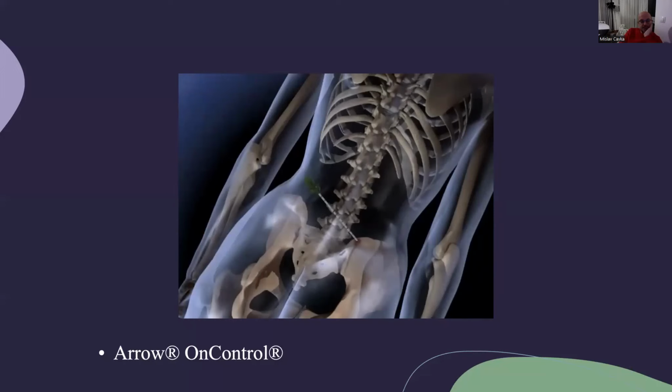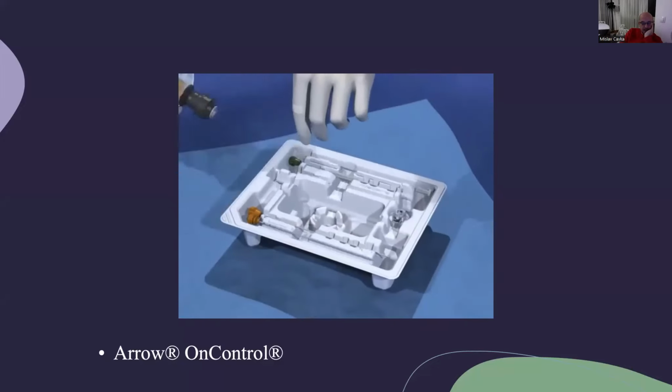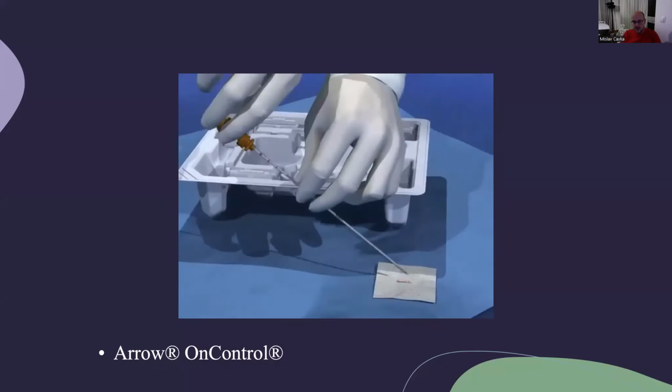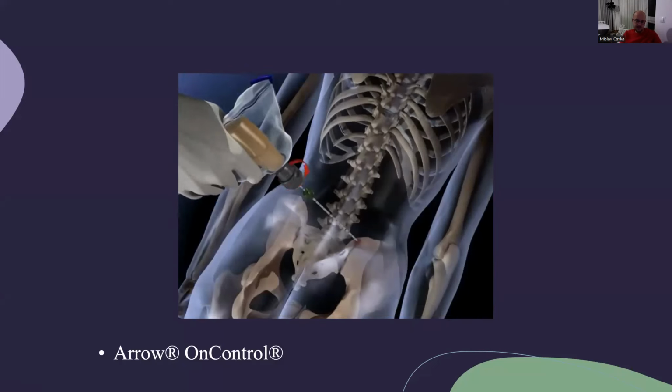Then through this coaxial guidance needle, we insert the bioptic needle, and we take a 1 or 2 centimeter long sample, which is then used for analysis. We can take several samples with these needles.